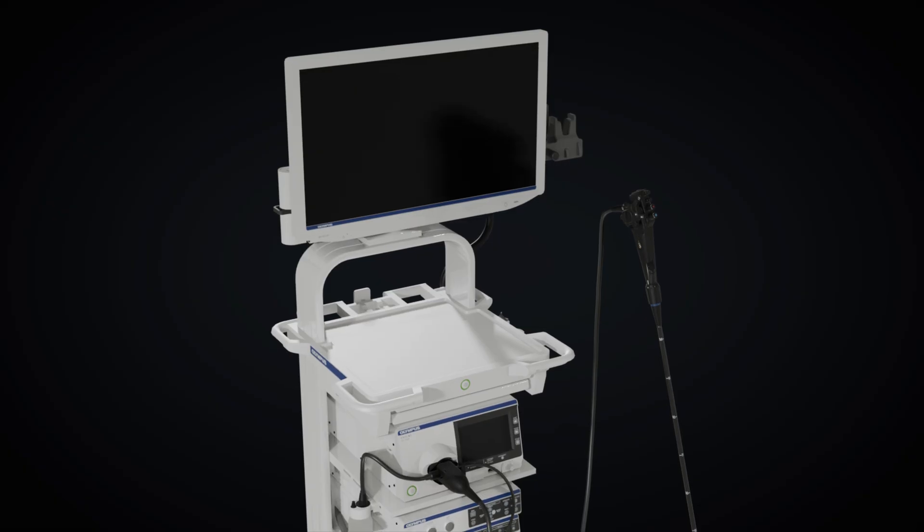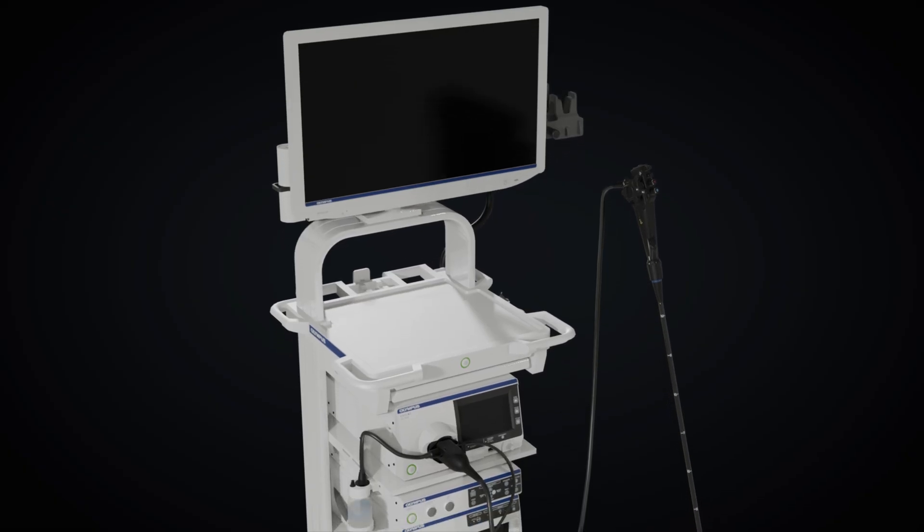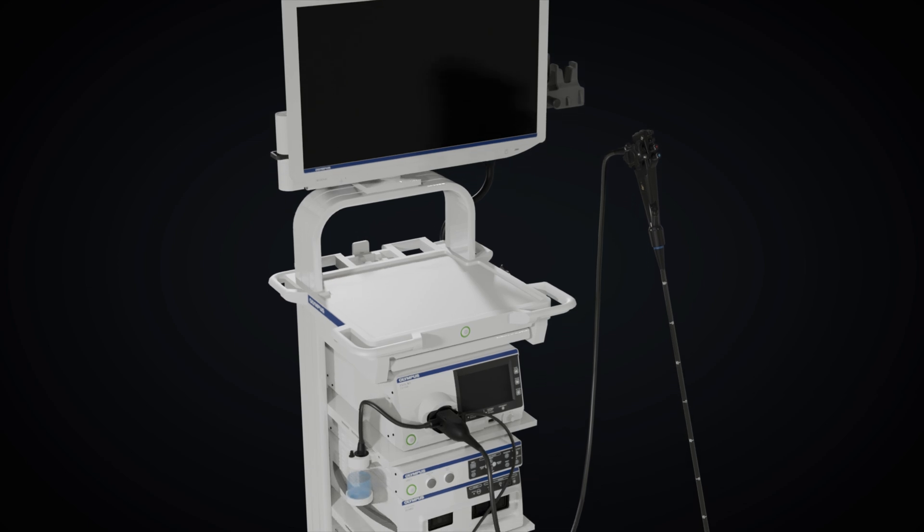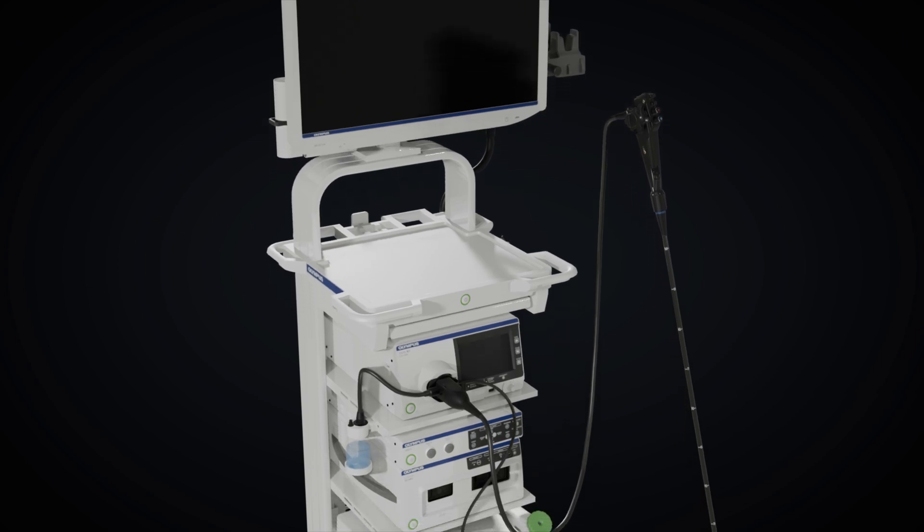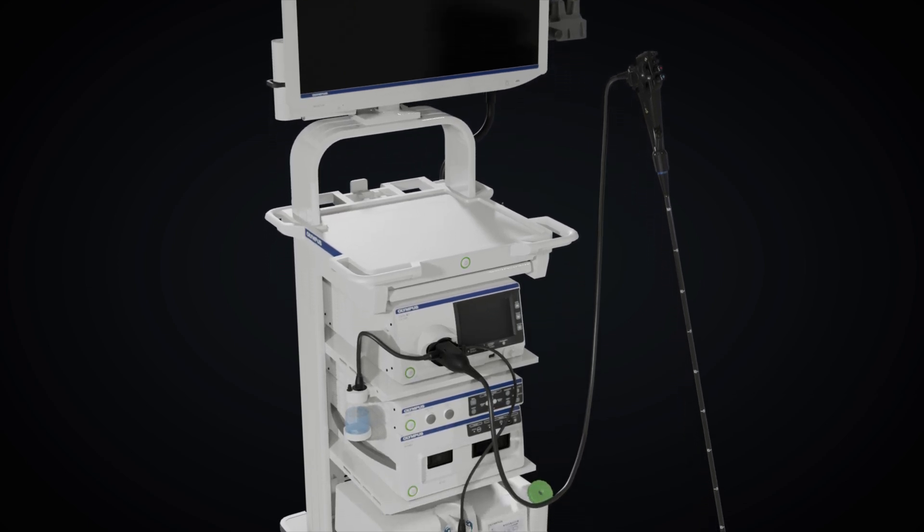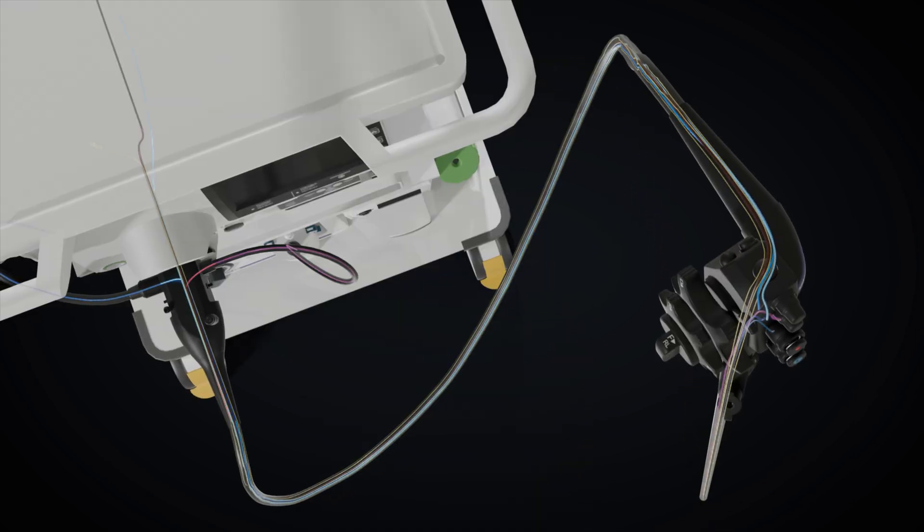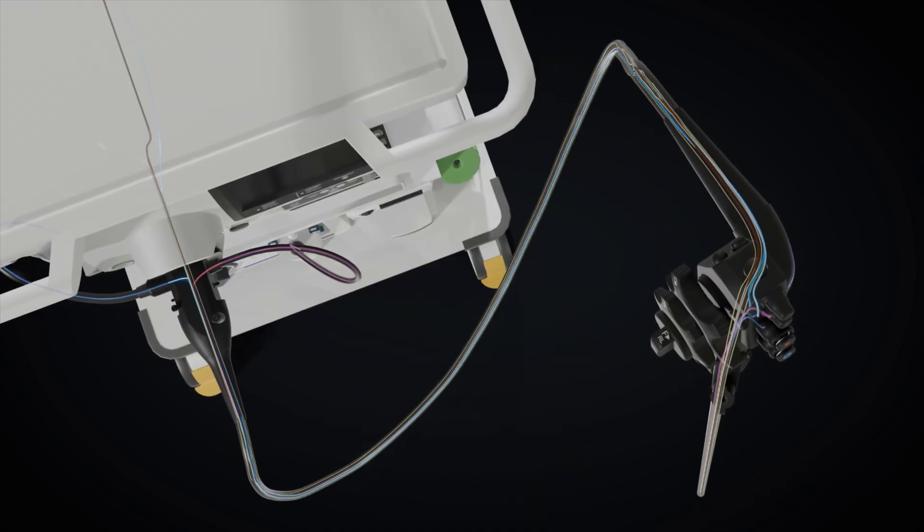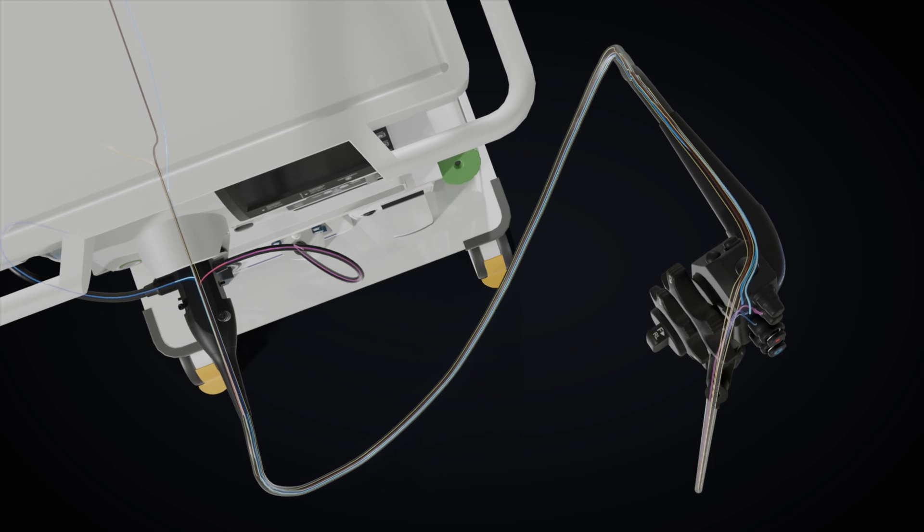The connector section interfaces the endoscope with the video system center via a universal cord, facilitating air and water supply through this connection.